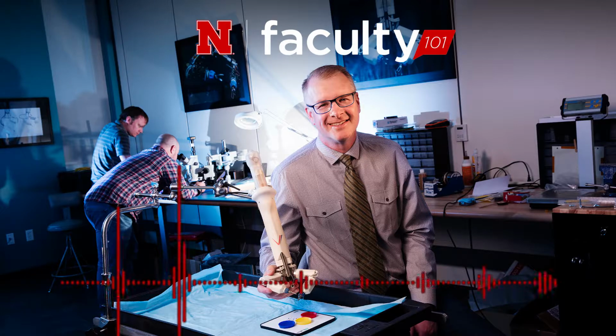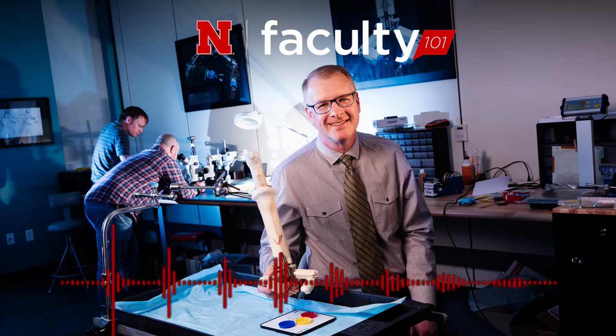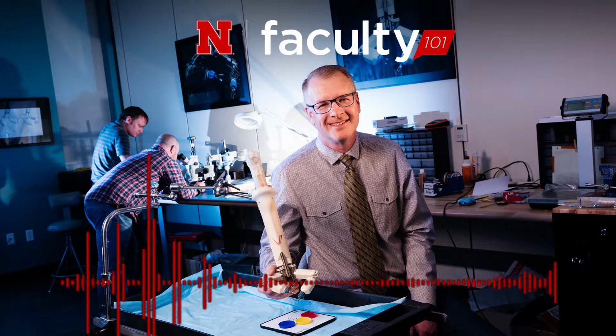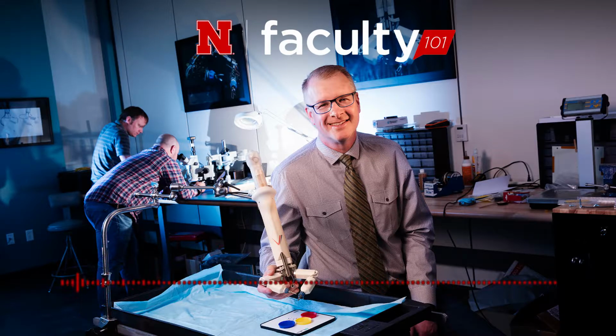Dr. Ferreter's research is supported by the U.S. Army and by NASA with an eye toward developing technology that would allow surgery in remote locations. So the idea is if you had a small portable device in a remote, dangerous environment, that you could then have the surgeon in another location and perform surgery remotely.